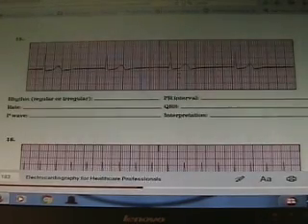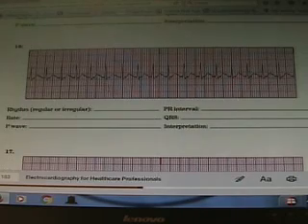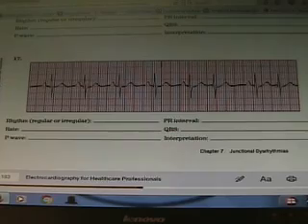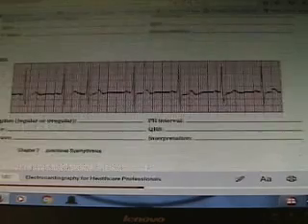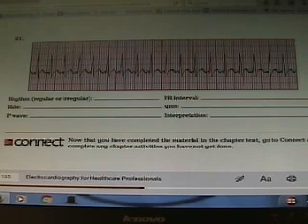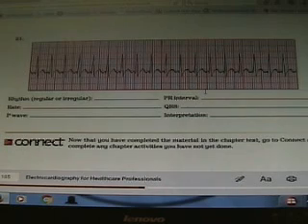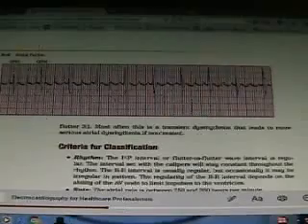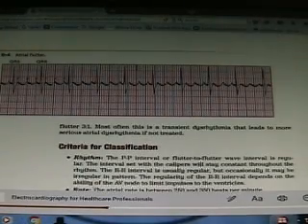Here, another junctional escape, and how do we know? No P wave. Junctional tachycardia. Here's one a little early, so that's how you know it's a PJC. Okay, and there's several more, and another PJC. You can see it's like wash, rinse, and repeat. And of course here, ugly, ugly, ugly SVT. SVT, scary. Do something. Stop the machine, call your chain of command. Okay, go through those. And that was quick. Barely fighting to stay normal. Look at that. That's not good.